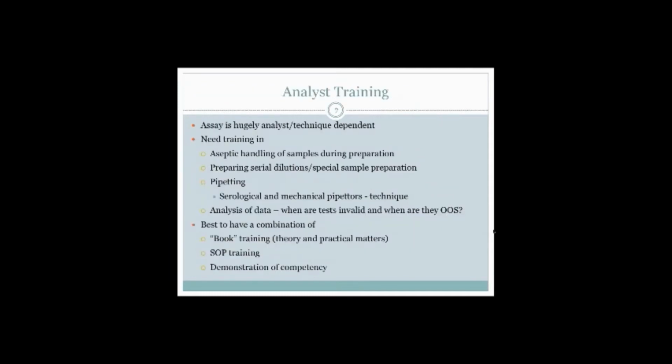In terms of the analyst technique, it is just hugely important here. We need training in aseptic handling of samples during preparation. We need training in serial dilutions. Serial dilutions is probably one of the greatest sources of error. We need training in pipetting.